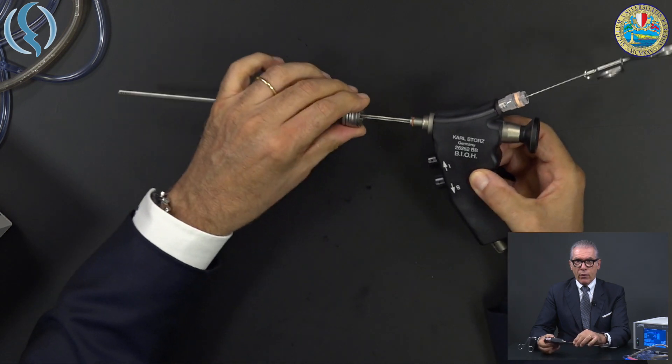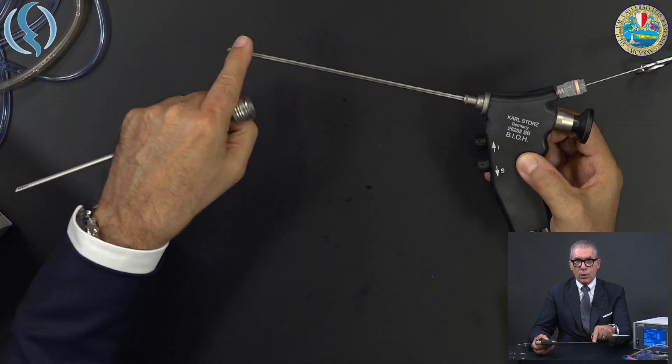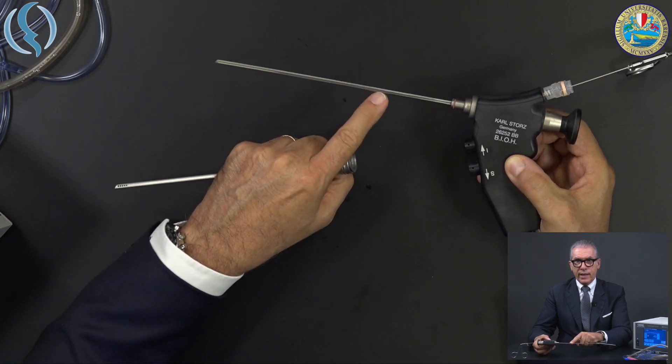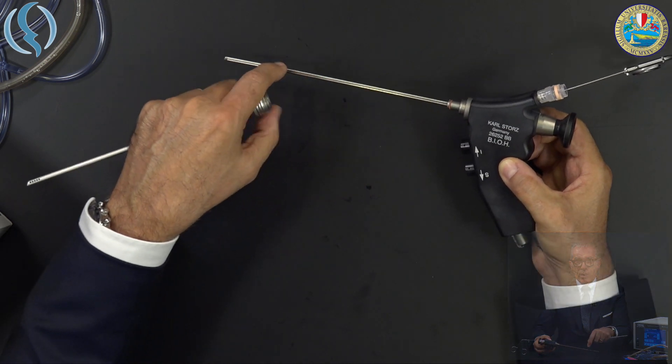And the final point, we have only one sheath, being the lens included in what before was considered the internal sheath. You see here you have the lens and the operative channel on the top.